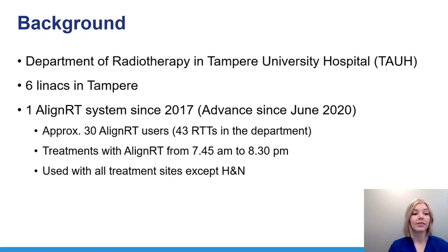Okay, some background information. We're placed here at the Department of Radiotherapy in Tampere University Hospital, Finland, and we have 43 radiation therapists working here in Tampere, and in a day about 130 patients are treated with 6 Varian Linacs, 2 of which are TrueBeam STX, 2 basic TrueBeams, and 2 older iX Linacs. The AlignRT system is installed on one of the regular TrueBeams.